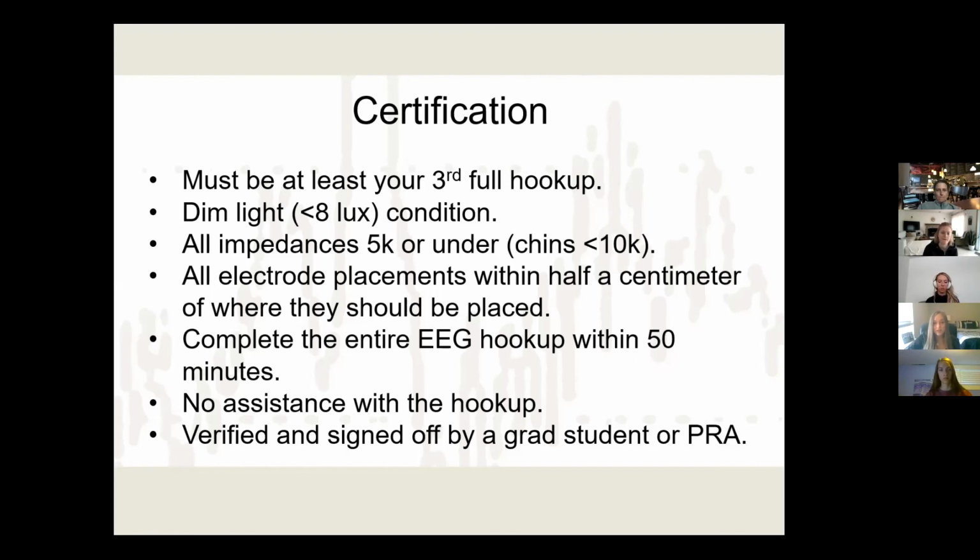And usually, or I know for C2CM, because I've been working on the flow sheet, you will have longer than 50 minutes to complete these hookups, but it's just making sure that you're sufficient in being able to do hookups in a decent amount of time, because sometimes you don't have a ton of time. No assistance, obviously, and then a grad student or a PRA has to verify and sign off. Does anybody have any questions about getting certified?